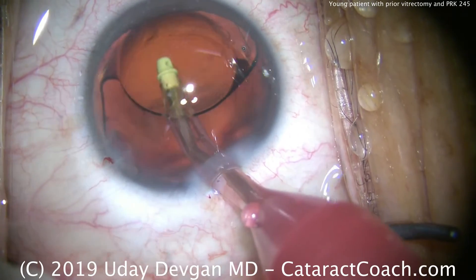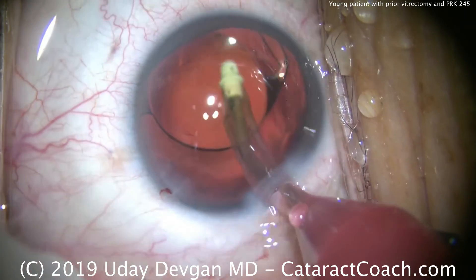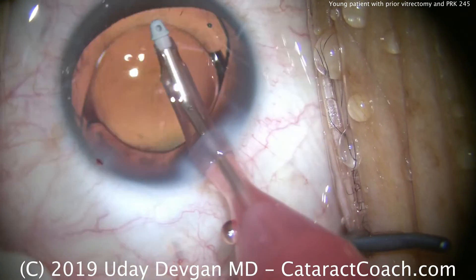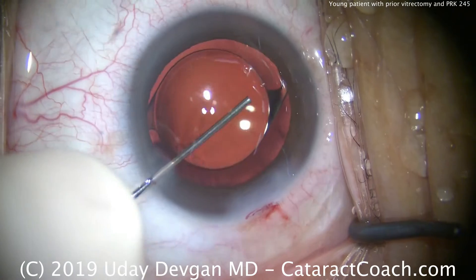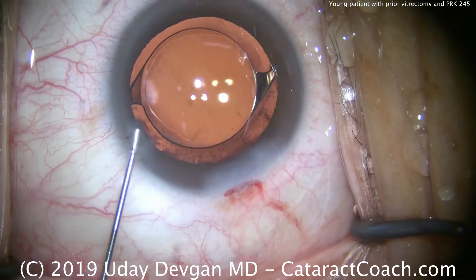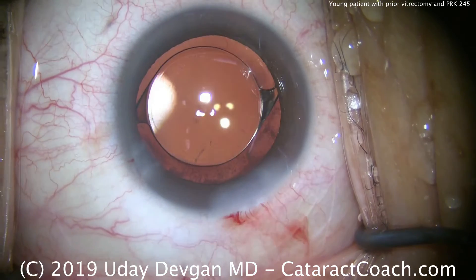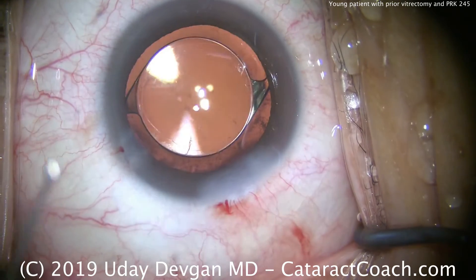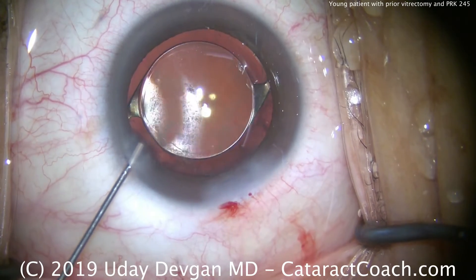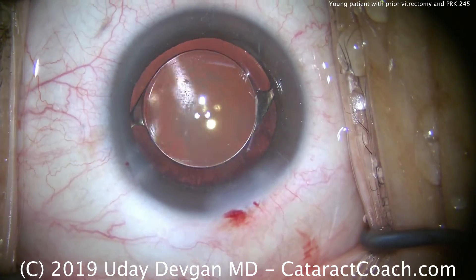We'll go behind the optic now to remove the viscoelastic from behind it — that looks nice and clean. Center up the lens. The pink sleeve on the instrumentation is the smaller one. At the end of the case, we seal up the incisions — beautifully positioned lens with great overlap of that rhexis. We're putting in some preservative-free Triamcinolone to help control post-operative inflammation.